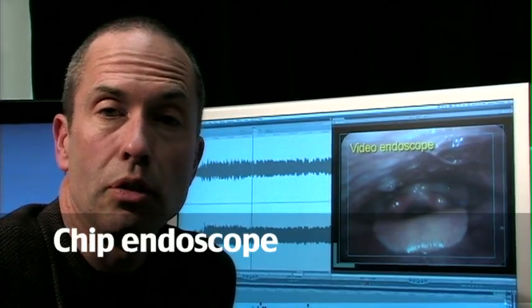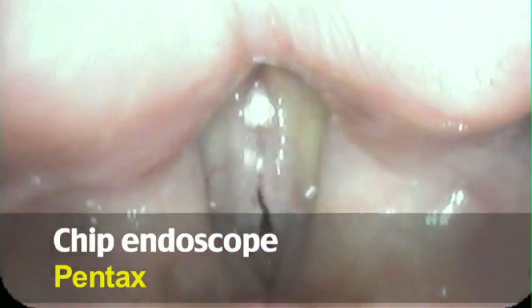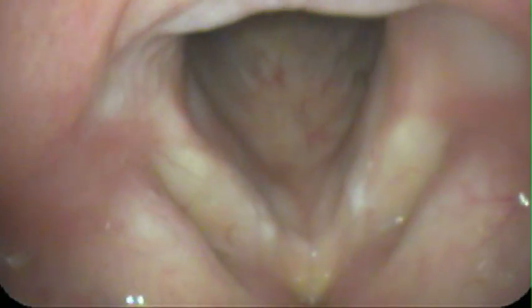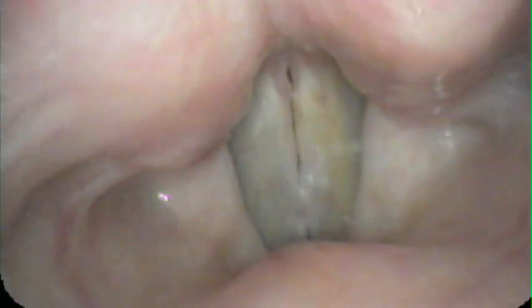With chip endoscopes, there are a couple of manufacturers. I've been using a Pentax scope for a while, and I think it gives a very clear view. Looking at a rock singer here, we can see that there's hemorrhage and there's a polyp. Watching on the strobe, we'll see that one side is stiffer than the other — the left side doesn't vibrate as much. And we have a reason for why they would struggle with making sound during a concert.